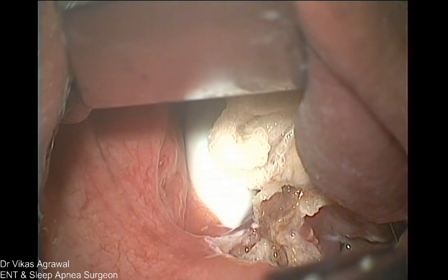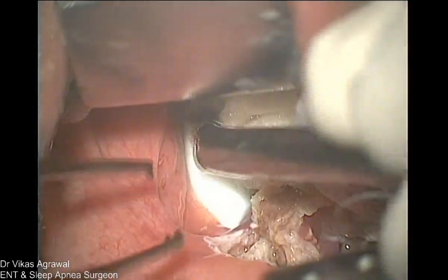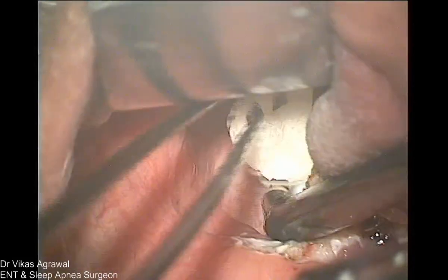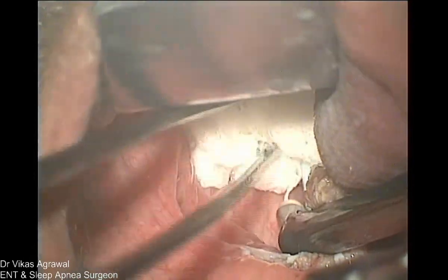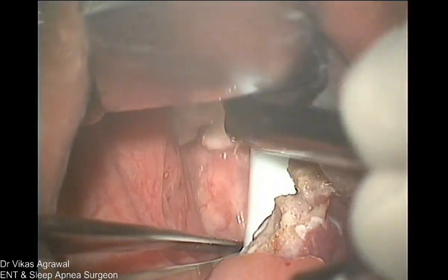Okay. So now, this side will have a little difficulty because the tube will come here. But if the tube is really coming in our way, we'll shift the throat pack to the other side so that the tube is pushed a little bit to the other side. So we'll get some space.